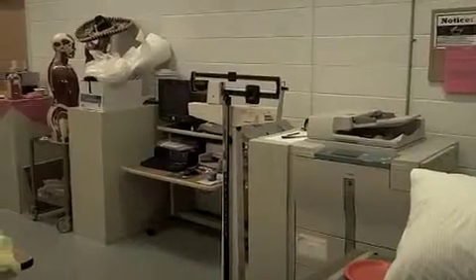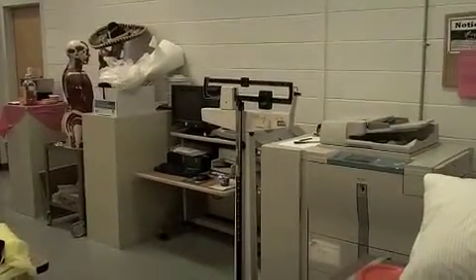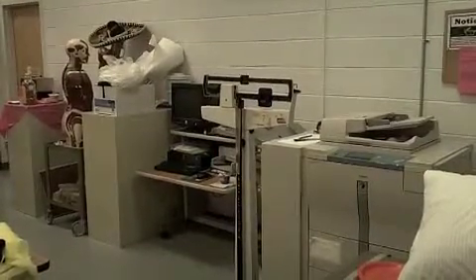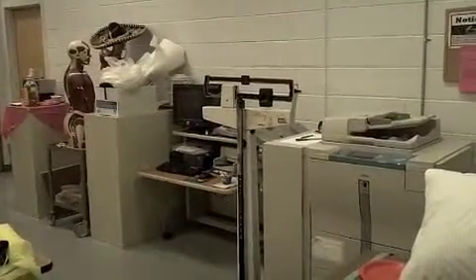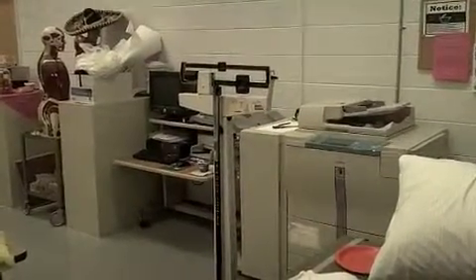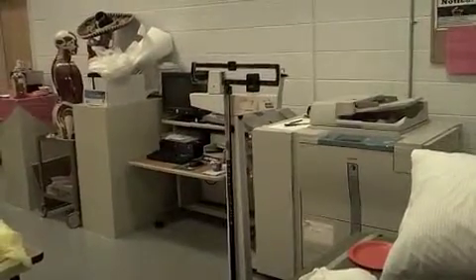Now, let me tell you this. The starting position for this skill is with the patient sitting at bedside. So the evaluator will have the person sitting here at the bedside. Okay? And then, if you'll put your shoes on, please, ma'am. All right. Okay. All right, let's just stand up, and I know you can walk. I'll just be here if you need me. Okay. And when you get to the scale, stop.